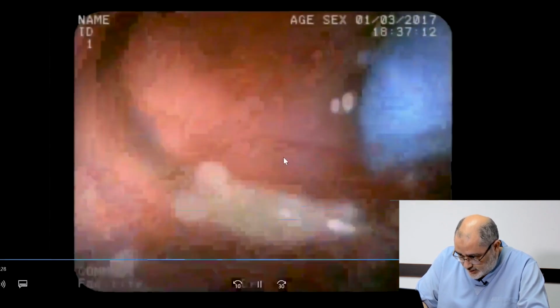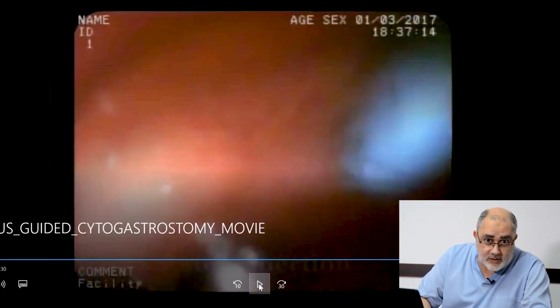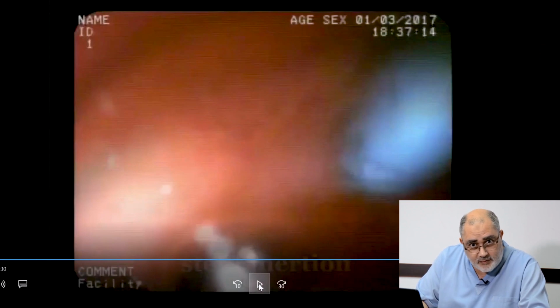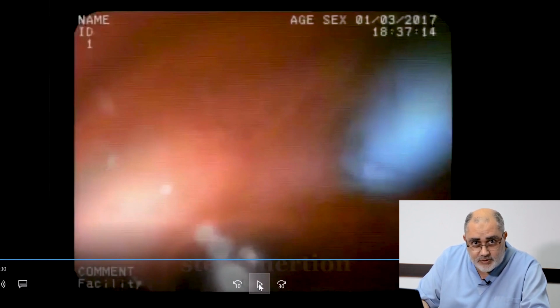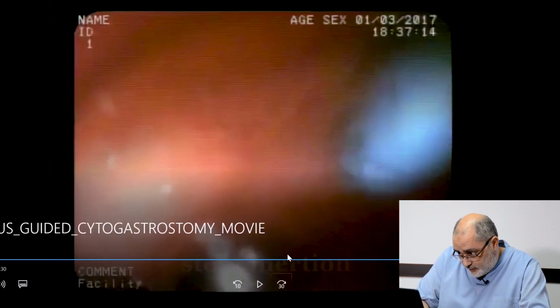If I tried to look at the gastric view, then I should do some downward deflection by the big wheel, to push the big wheel away, to do downward deflection of the echo endoscope to see the stent, and this may make you lose your best position.